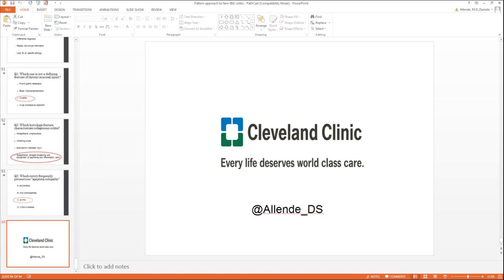I use denudation of the surface epithelium when there's a sloughing off of the epithelial cells into the lumen. And I showed you a case of collagenous colitis that didn't have any ulcer, and the epithelial cells get denuded. That's when I use the term denudation of the surface. Ulcer, I use more when I see granulation tissue. So the mucosa is fairly gone and replaced by granulation tissue. And that's my personal take on how I use those two terms.